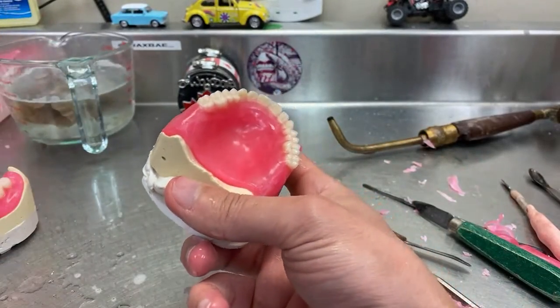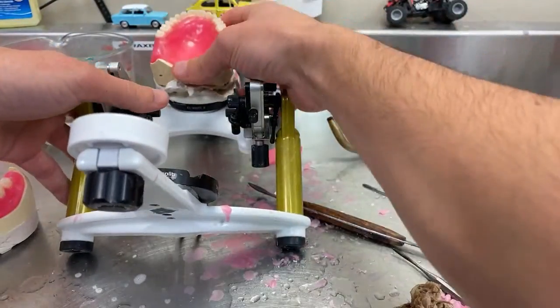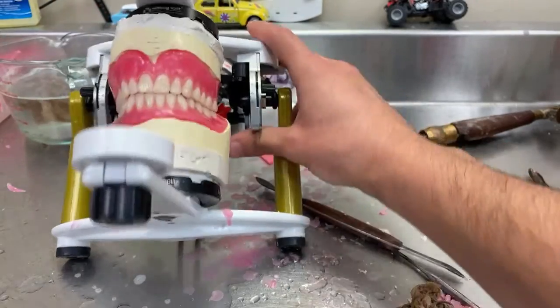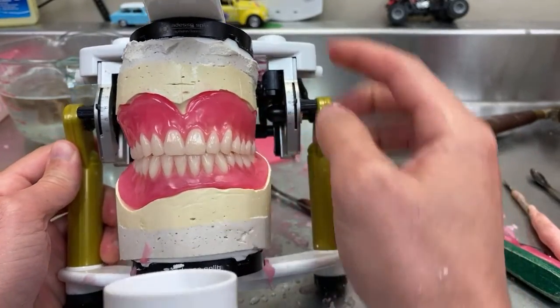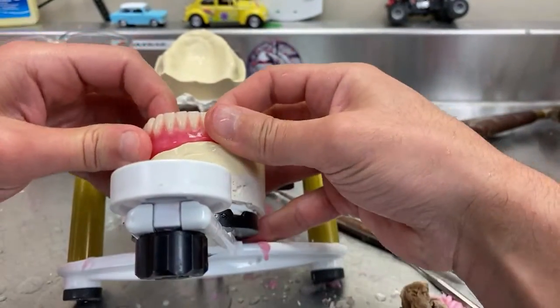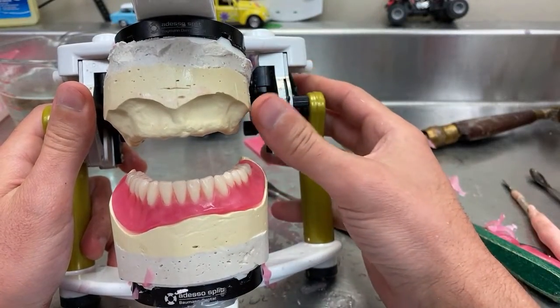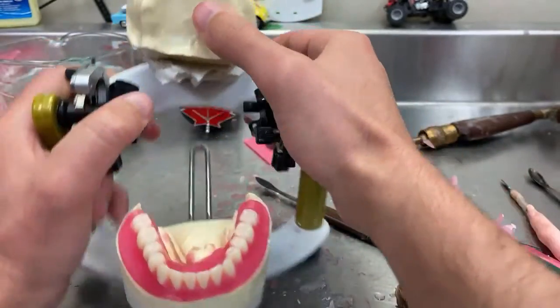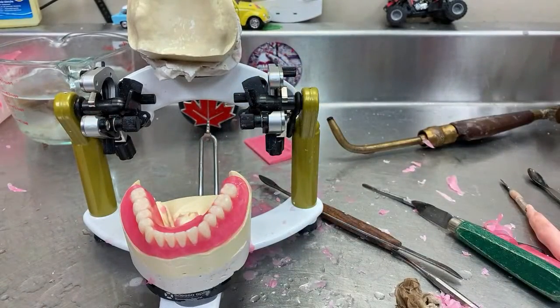So that's pretty much it. I'll put it back on the articulator. Boy, almost put it on lower. And yeah, there you have it there. Oh, I said I was going to show you where the ridges are. Oh, but you can see that the ridge is more towards this side here in order to have a full occlusion on the lower. So it's actually the lower that is away. Oh, my hand's slippery.